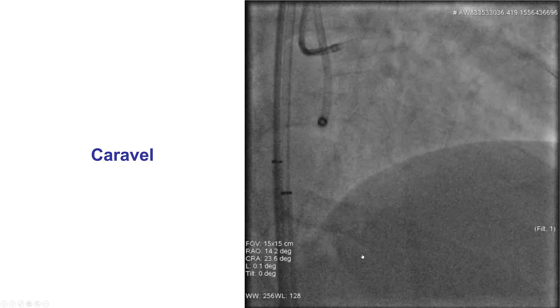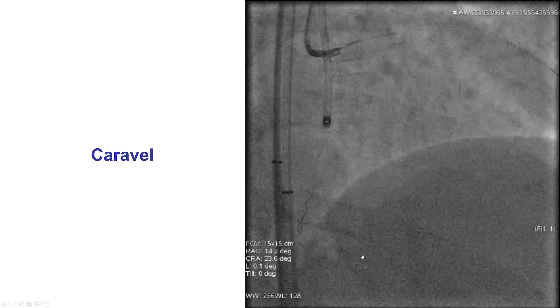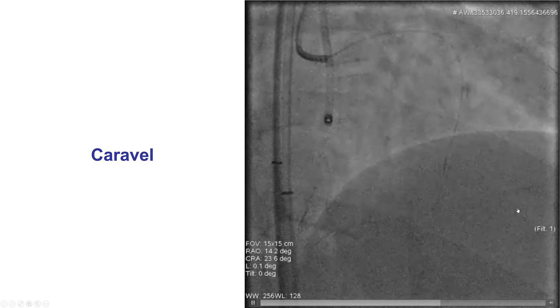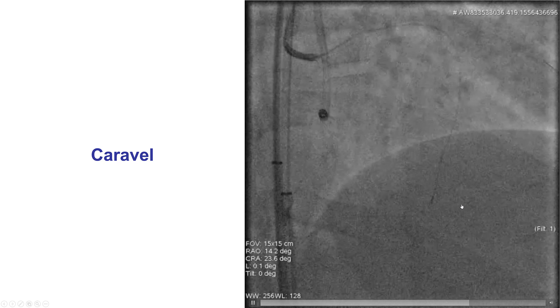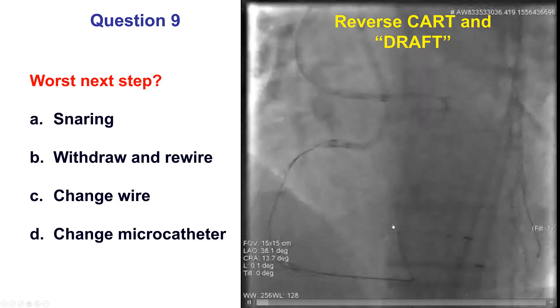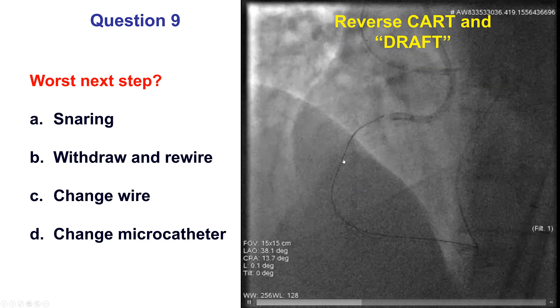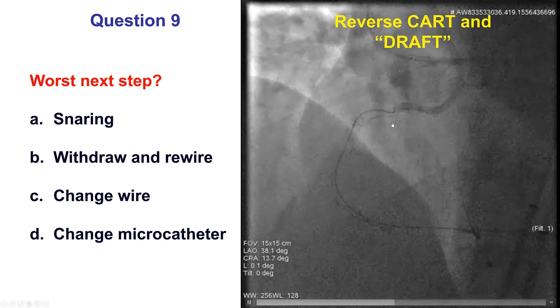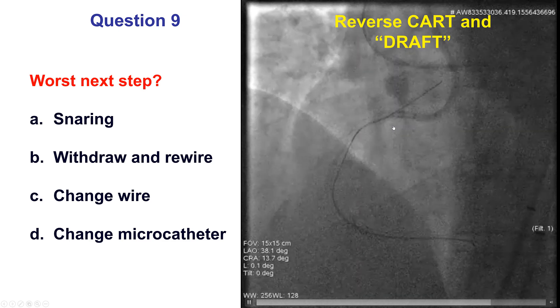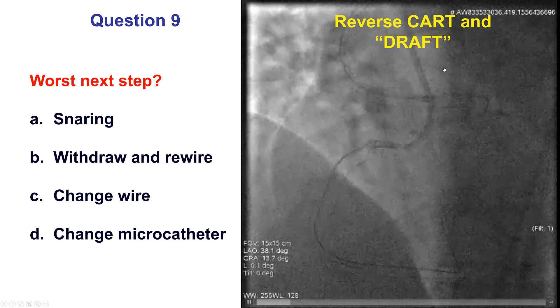In this case, we tried a Caravelle and, to our pleasant surprise, the Caravelle tracked fairly nicely all the way down to the distal right coronary artery. It was advanced with knuckling all the way back to the ostium of the right coronary artery, and then eventually the wire went out into the aorta.